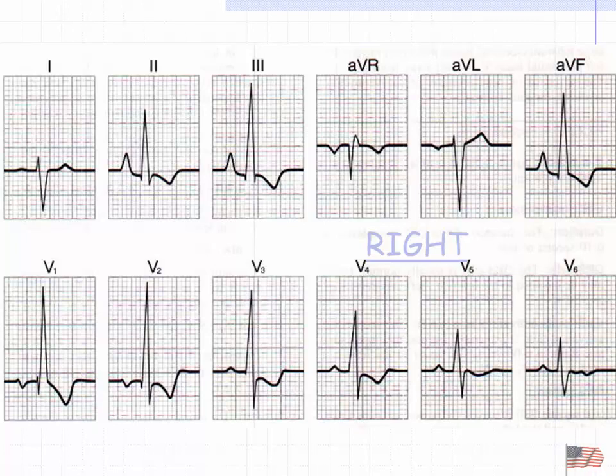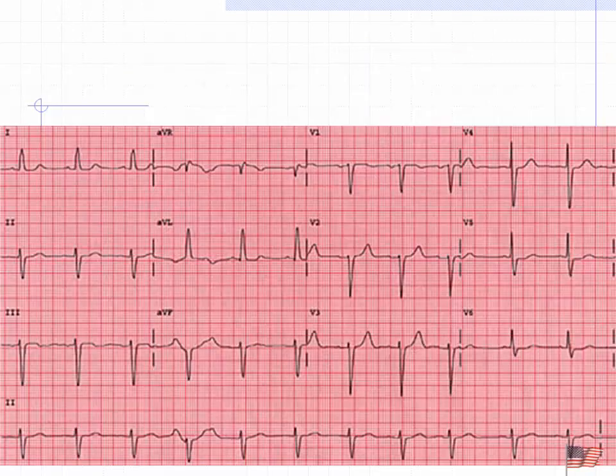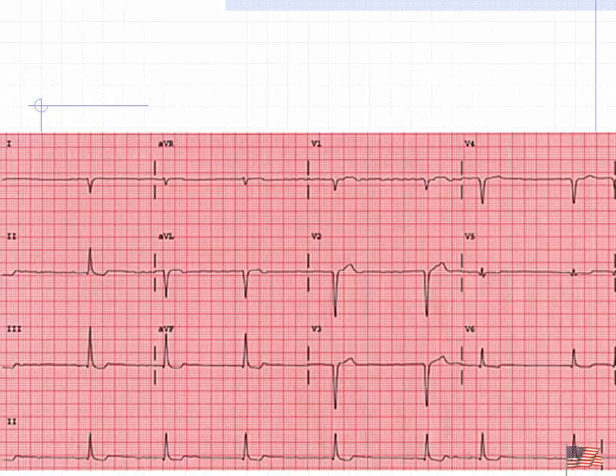We won't talk about bundle branch blocks yet. We just know they got the bunny ears. One more. Lead 1 is up, yes. But AVF is negative. So it's in left. So not. Left. Just a matter of practicing. Okay? I will post these slides, yes. One more.